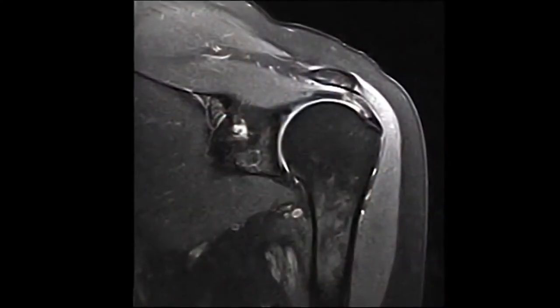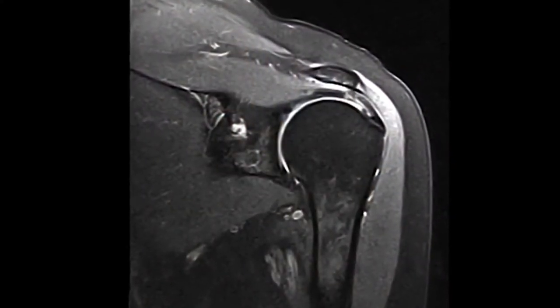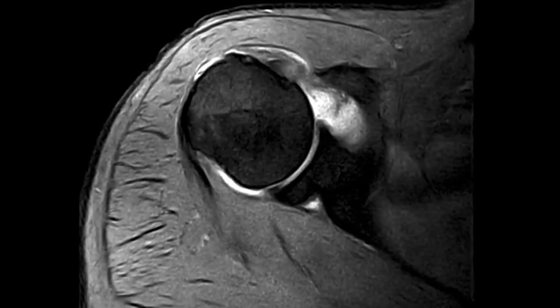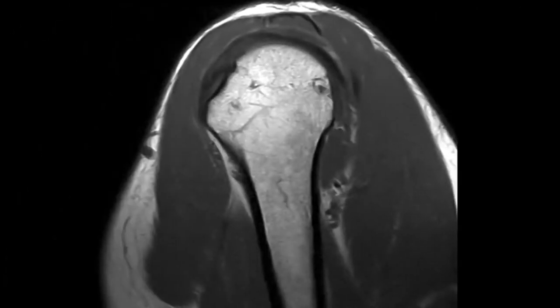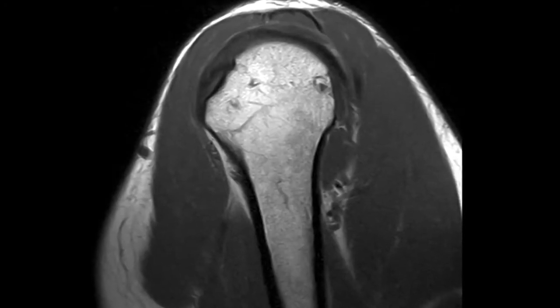For MRI of the shoulder, there's actually a benefit in the open system because you can position the patient with the shoulder in the isocenter, while in a closed cylindrical magnet, the shoulder will always be off the isocenter and might affect the quality of the images. So we have very good results from our MR shoulders. Certain patients, let's say obese patients, by placing the shoulder in the isocenter, we might get better images, and we have cases where I believe the images are better than a 1.5 closed system.